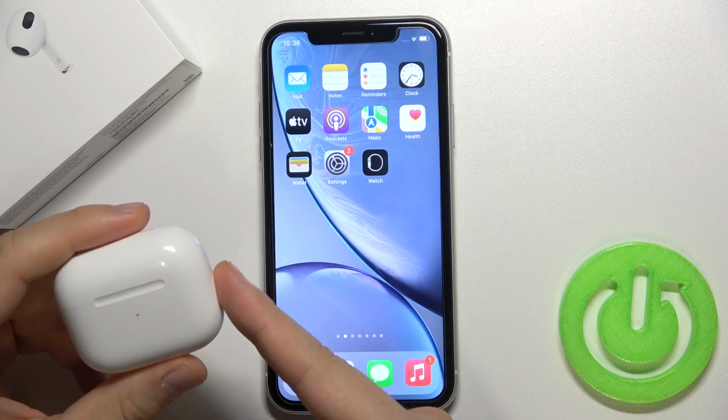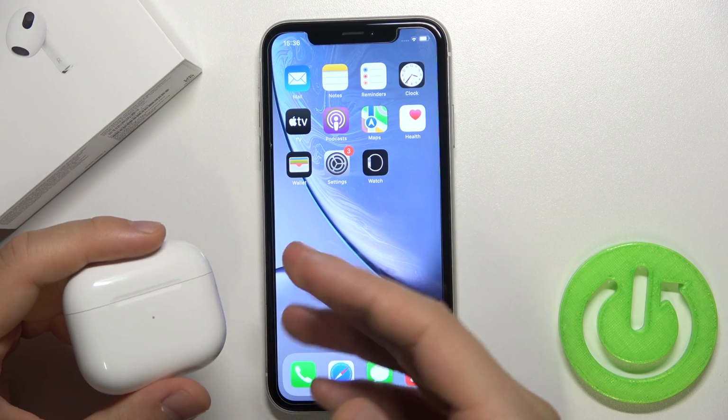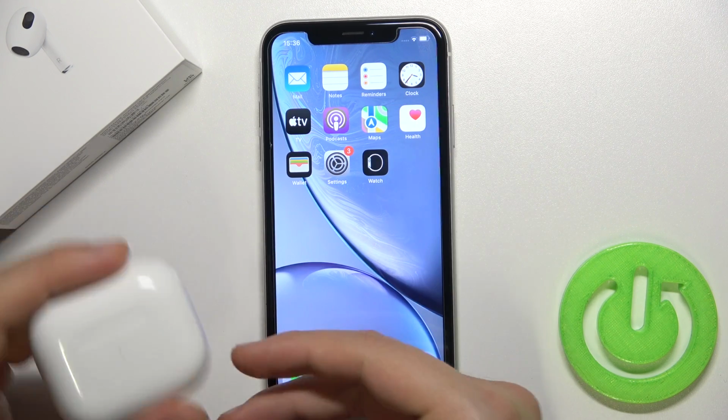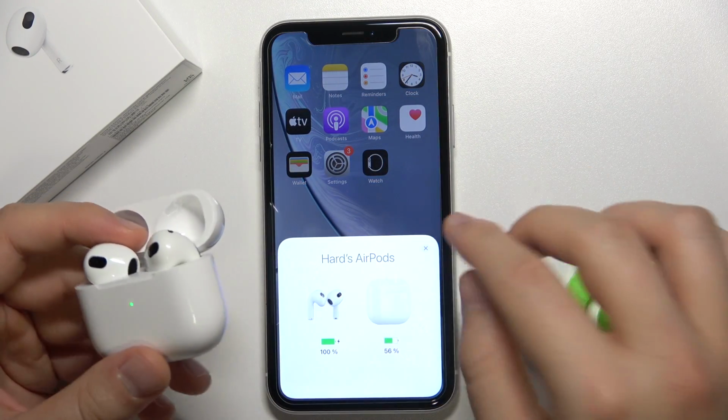Welcome, today I am with AirPods 3 and I will show you how you can activate Live Listen when you are connected to an iOS device. In this case I'm using an iPhone XR. So at first we have to open the case of our AirPods and be connected.